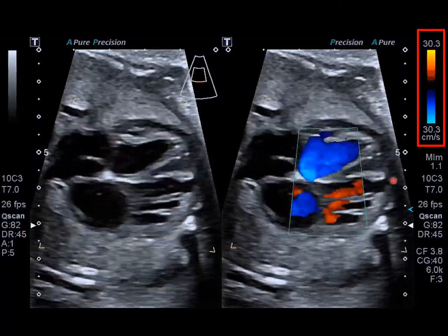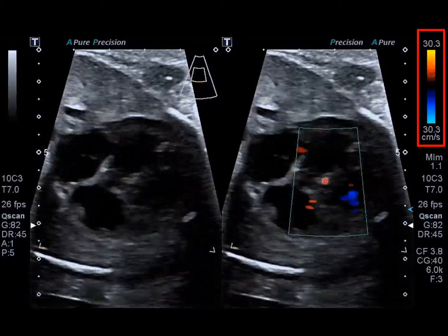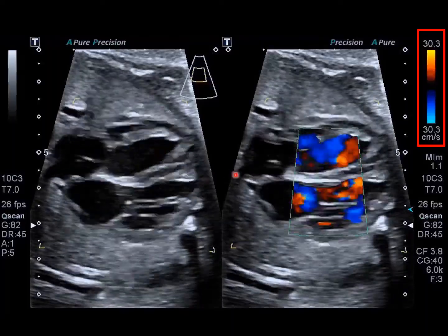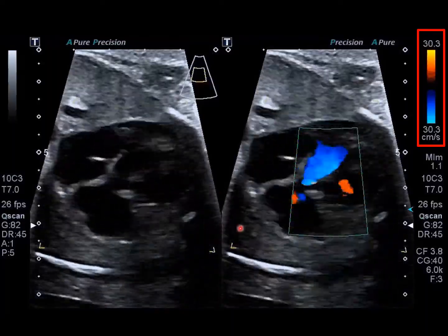You want to look at the ventricular septum all the way up to the base of the heart and do this little sweep up to the outflow tracts with 2D and with color. You can do it in separate cine clips with just 2D and with color.